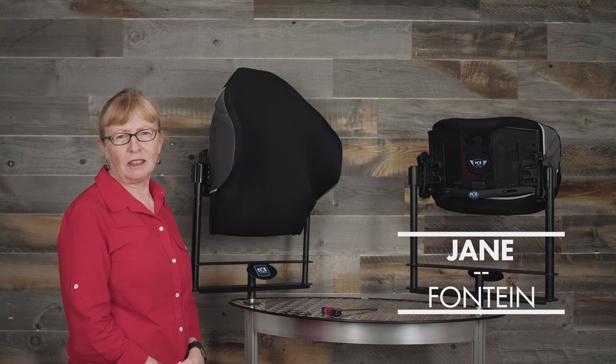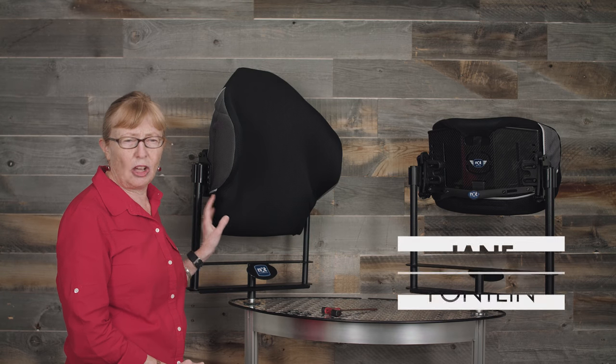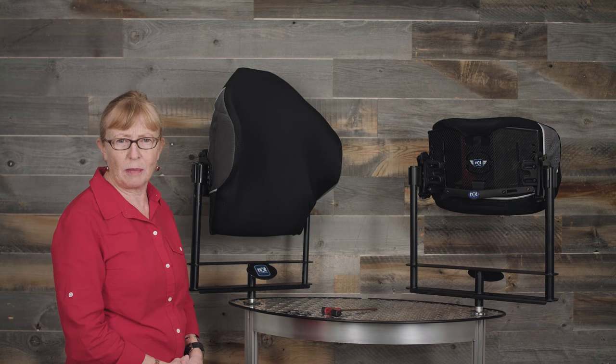Hello, my name is Jane Fontaine. I'm an occupational therapist and I'm here to show you the Optima and the Optima Carbon Thoracic Back Supports.